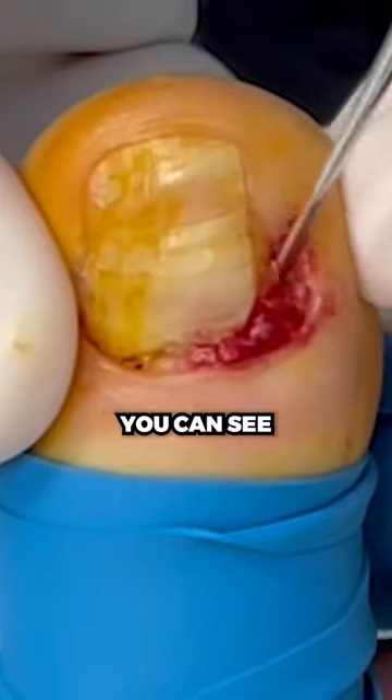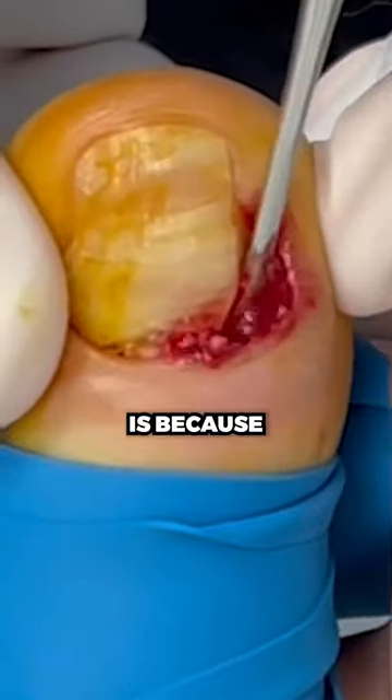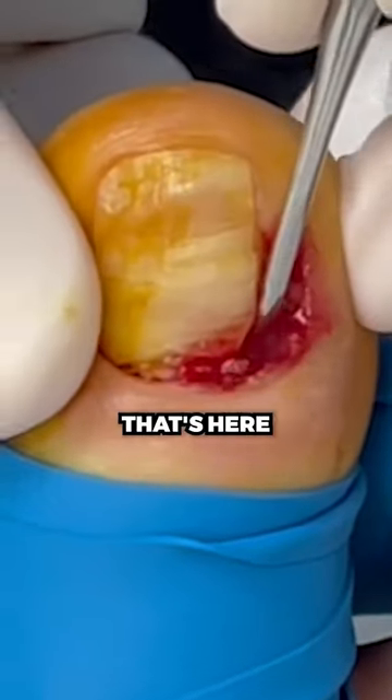All that abnormal tissue — you can see usually in these procedures you don't see a lot of blood. You see how this one's bleeding already a lot? It's because it's very abnormal tissue that's here.